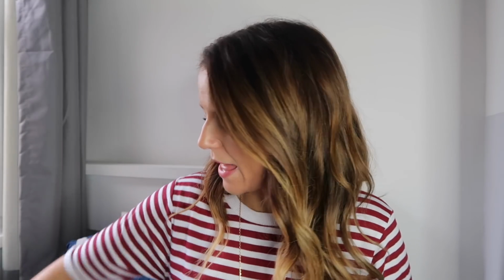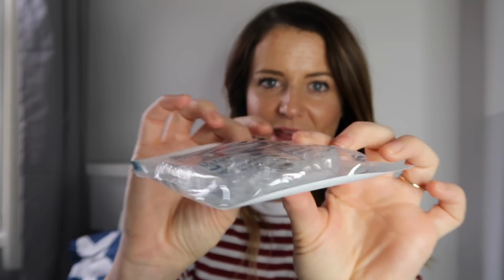So I've been using these boxes all the time, but I feel like I need to get some more spares, so maybe keep some in the kitchen or the living room, so that when I go to eat my dinner I can just chuck them out and put them in one of the boxes, and I might get one to keep at work as well, so that I don't have to lug them around everywhere. And then obviously you get these bags with your retainers in. There's my next set of retainers, and the ones that I'm wearing now were in there as well.